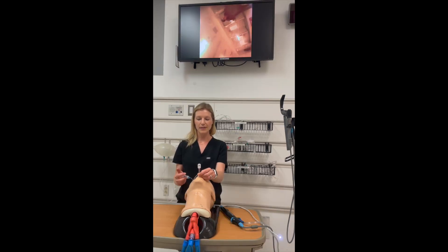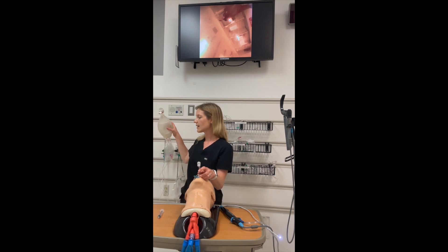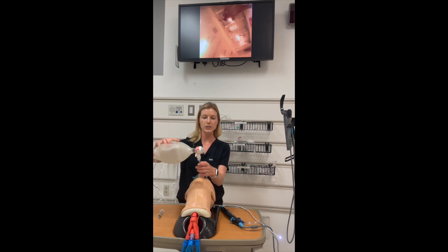Now that my tube is in place, I'm going to inflate my balloon and attach my bag-valve mask as I would with any endotracheal intubation, looking for both end-tidal CO2 and bilateral breath sounds. That concludes our procedural video.